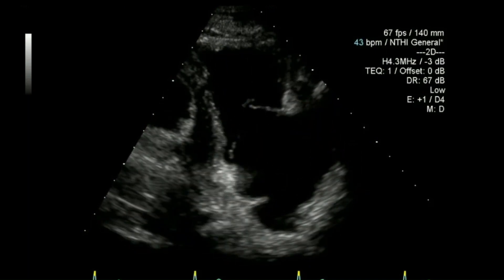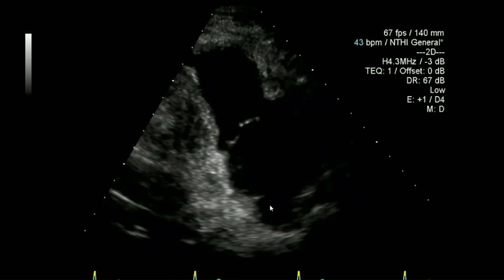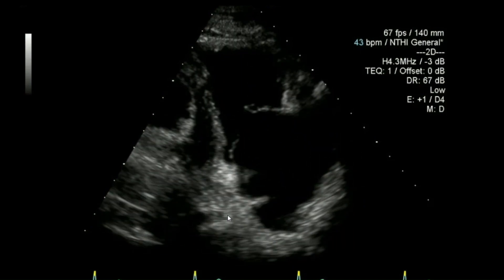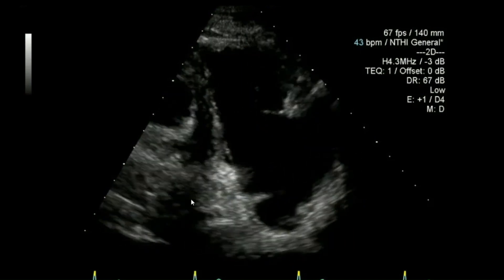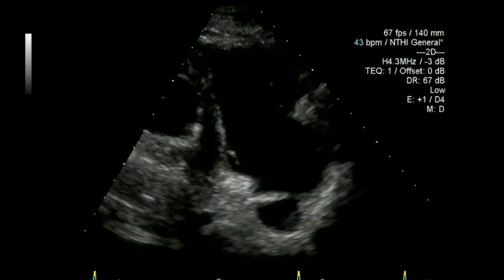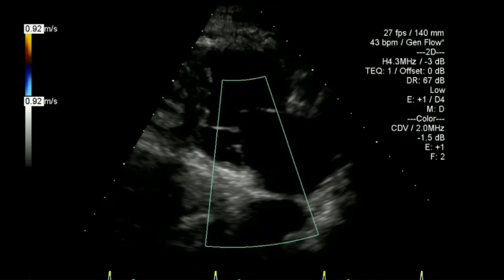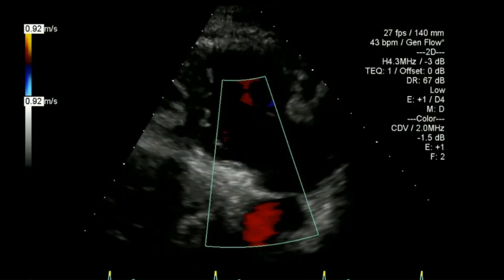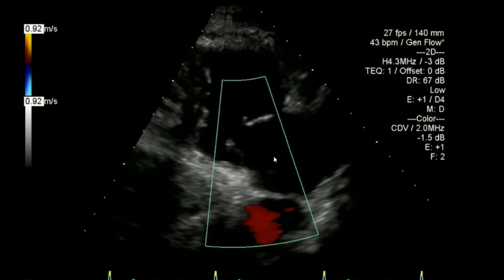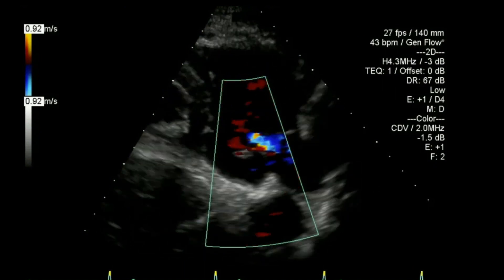With one to two centimetres behind the heart, you can see the orifice of the inferior vena cava and the coronary sinus coming in approximately there. There's a little bit of tricuspid regurgitation so I'll maximise showing that as much as I can.